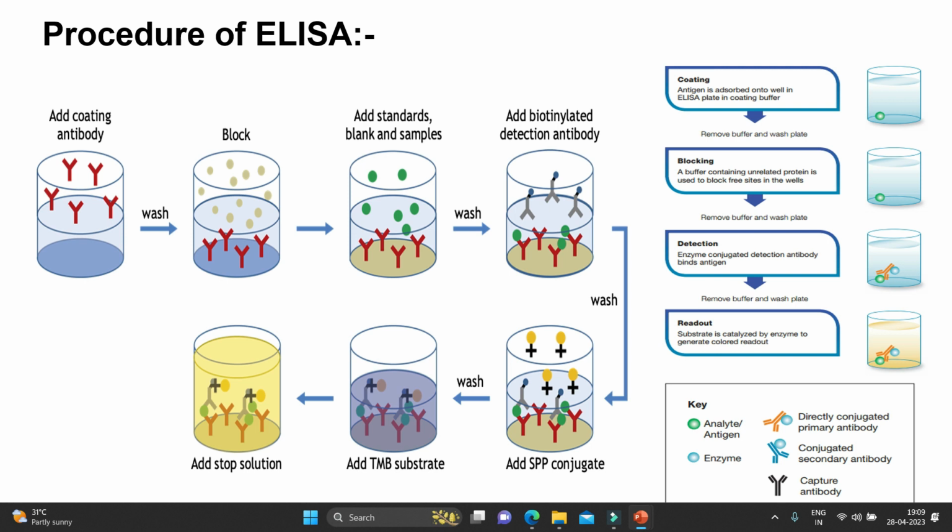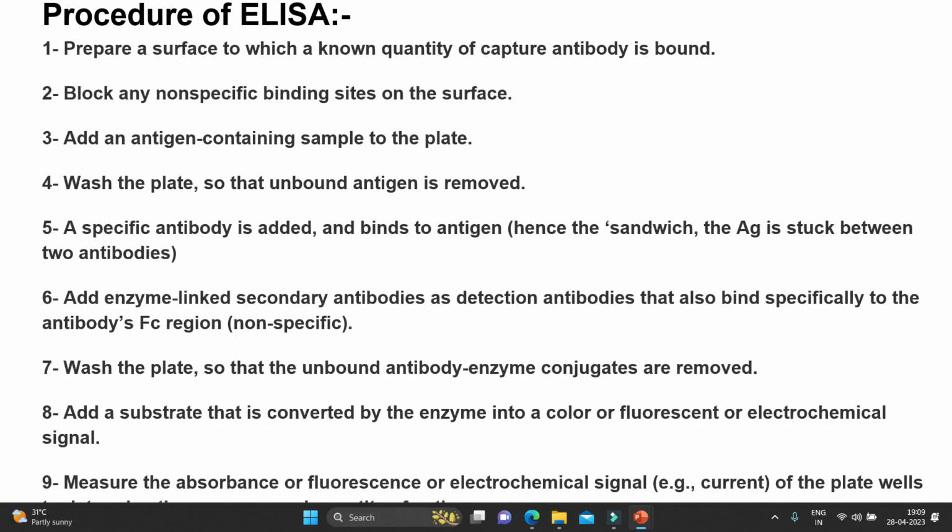So the antibodies are attached to the polystyrene plate, which is a solid surface and has an affinity towards bacteria, antibodies, and hormones. The microtiter well coated with an antigen is filled with the antigen antibody mixture, after which free antibodies are removed by the washing. Sir, go to the picture only, sir. I'm explaining the picture.